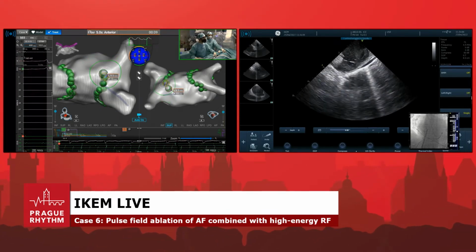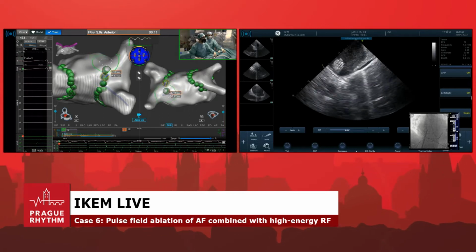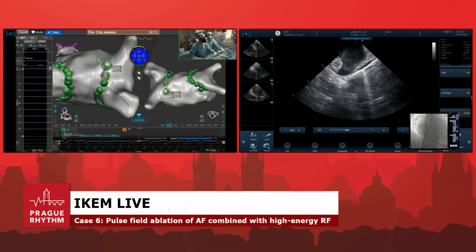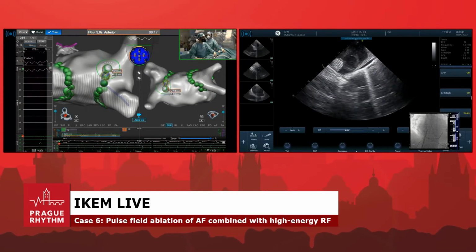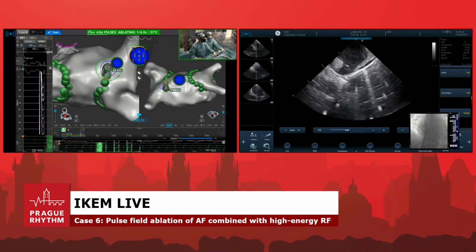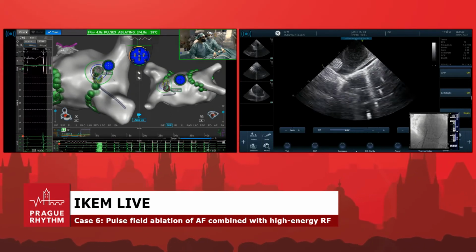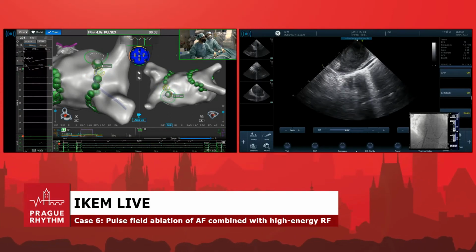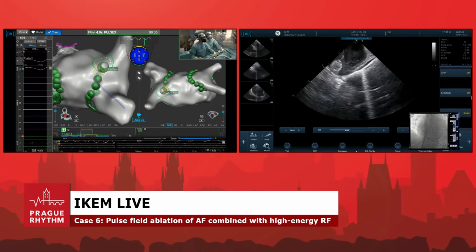No good contact. Push more. Going to push a little bit into contact there. This is perfect. So you can appreciate how fast this is. I mean, you do a lesion very quickly, and even if you do better contact, I'm not sure about the high density lesion.